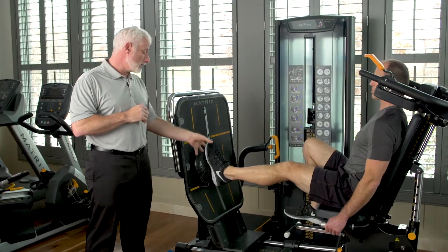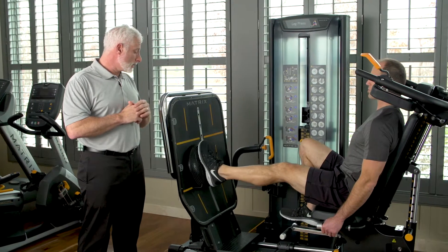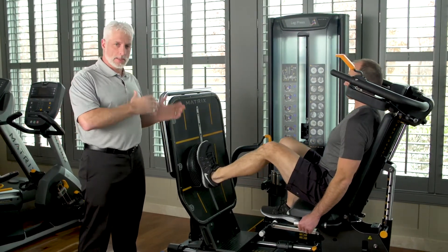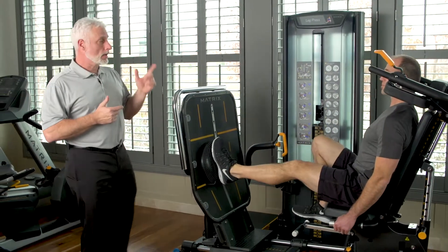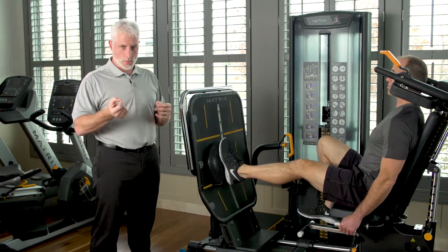Now, if we take the ankle and foot and move it forwards and backwards or side to side, you can get some different muscle forces in control of the ankle with the disc. You can also have him close his eyes, because then you get more sensory integration — you rely on your proprioceptors to control the motion.